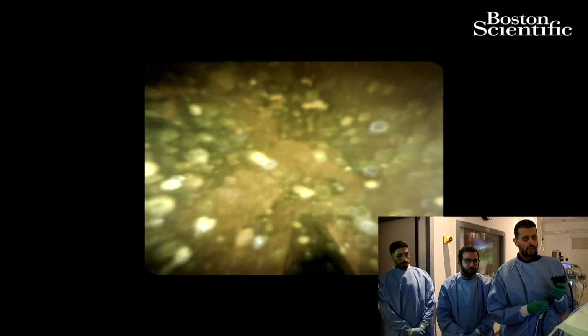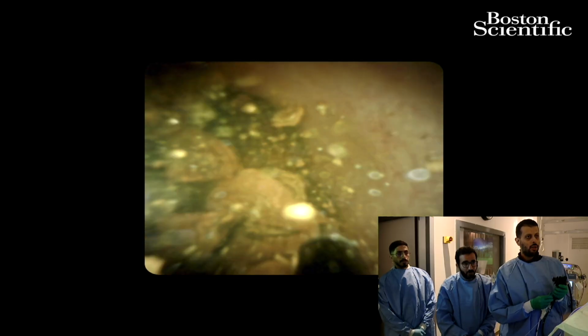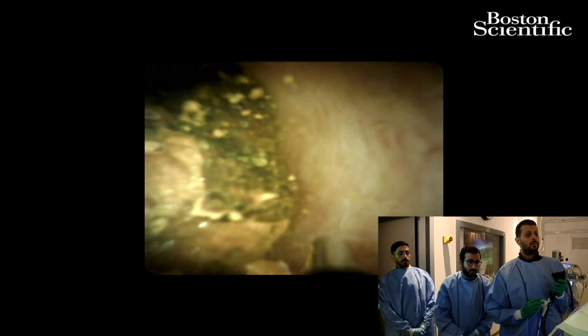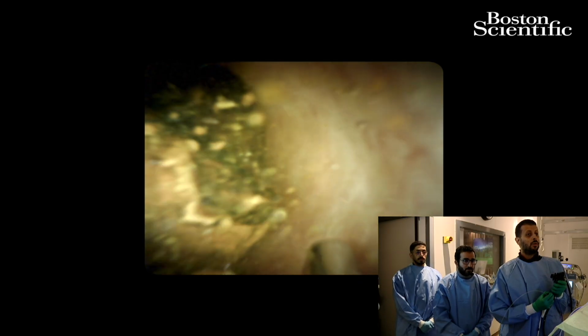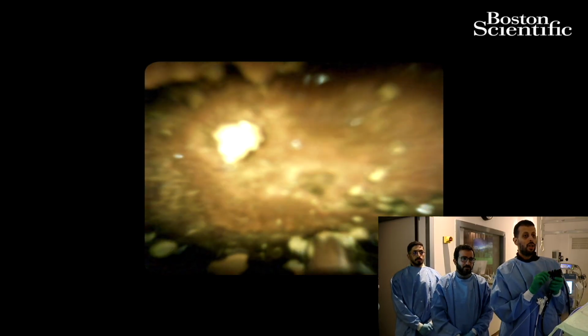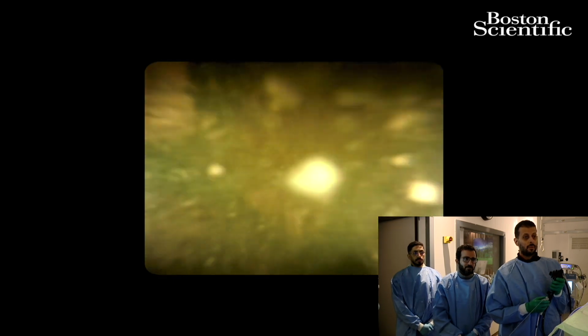So I think this stone is well fragmented, so we're going to go further here to more proximal stones. Go, doctor. Good. So try to stay away from the bile duct here. So this is a nice stone here on top of me. Go, doctor.